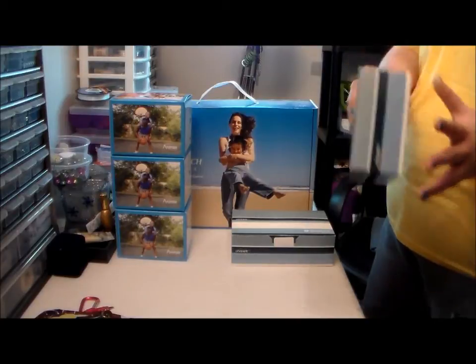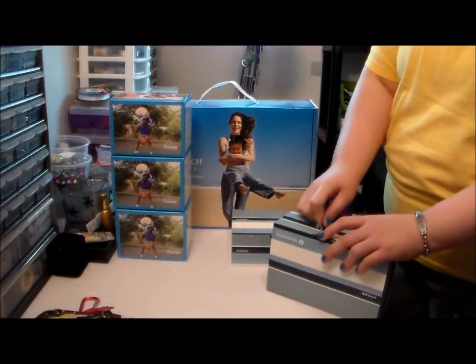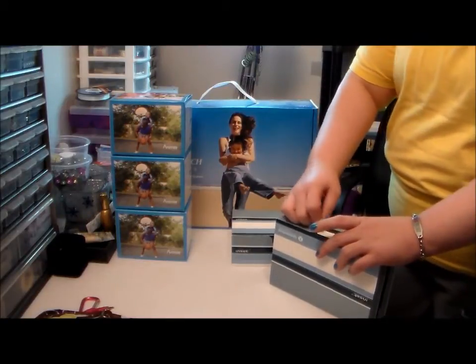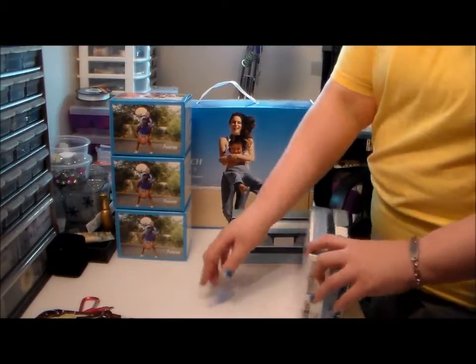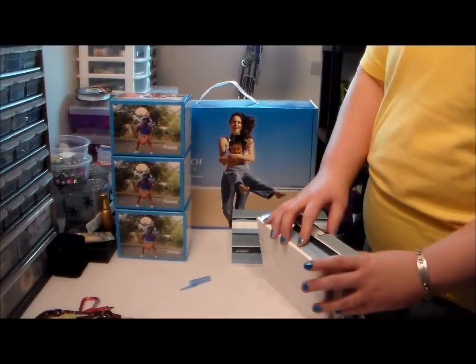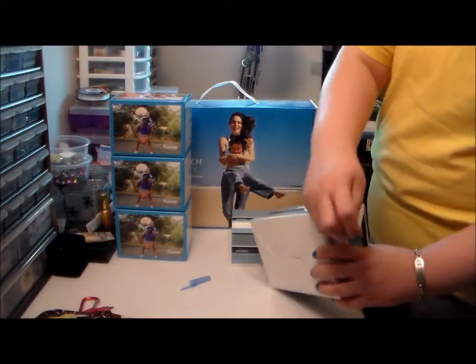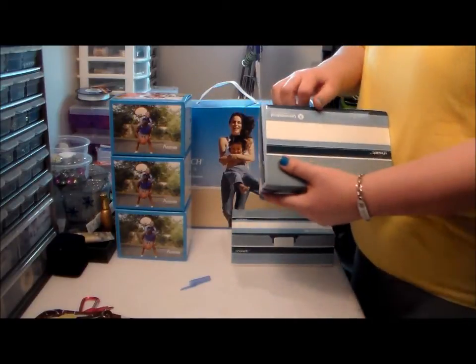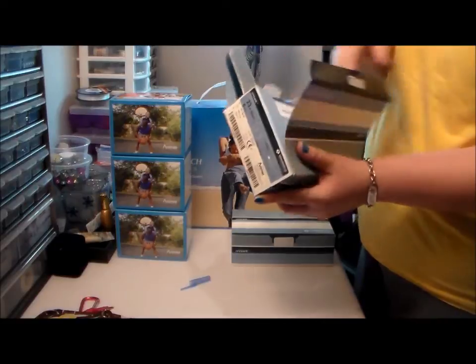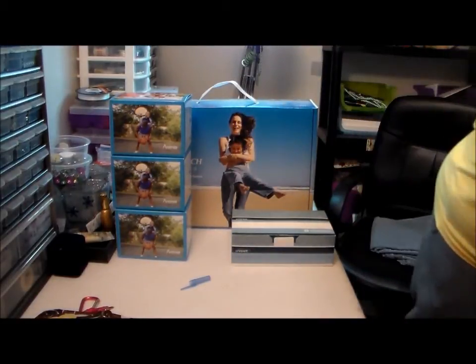My nose is a little runny — no, it's not allergies, thank God. I just had Chipotle for dinner, so some spices do make my nose run. Anyway, I was extremely excited to get this — well, not in the mail, but via UPS.